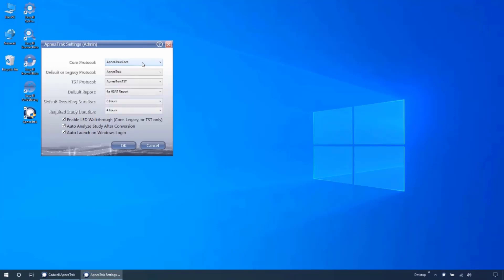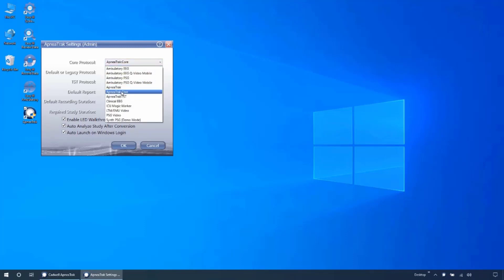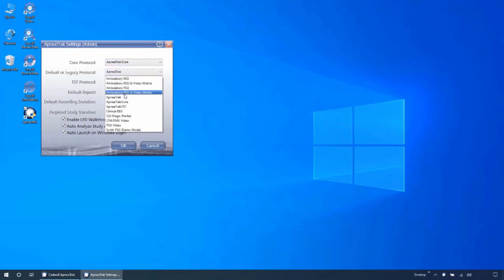For new installation, select ApneaTrak Core for the Core protocol, ApneaTrak for the Legacy protocol, and ApneaTrak TST for the TST protocol.